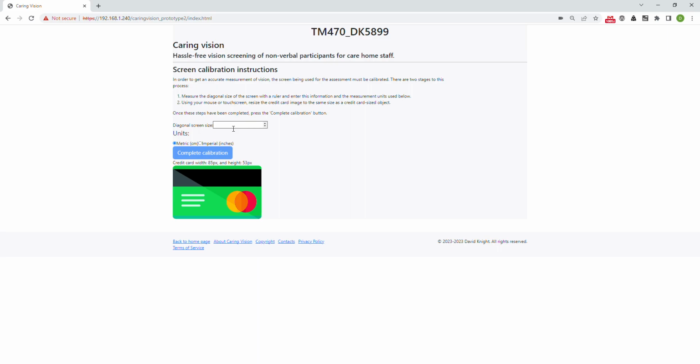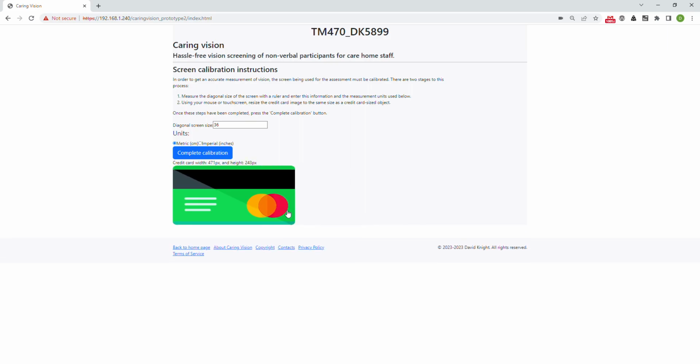So it's asking me to measure the diagonal screen size. So I'm just going to do that. And that's coming out at a measurement of 36 centimeters. So I'm just going to enter that into the box here. And we can change that to inches if we want, but I'm going to keep it at centimeters. And then it's asking me to change the shape of this image here to match the shape of the credit card. So again, I've got my little membership card here. Again, credit card size objects are pretty much ubiquitous nowadays in modern society, so pretty much everyone will have one.